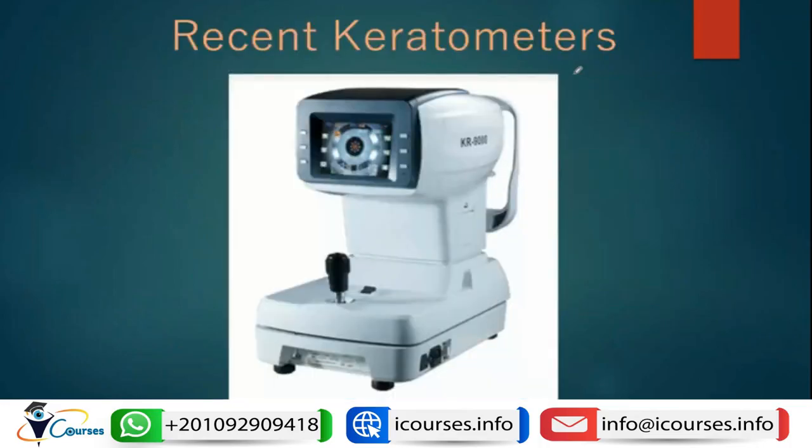Nowadays, the advent of the automated digital keratometers has made this job much easier. So just by the click of a button, you can calculate the axis of the keratometer and the power of the keratometric readings without the need to manually adjust it. So this is just like the use of retinoscopy and the use of the autorefractor. So it is just the normal evolution of the devices.